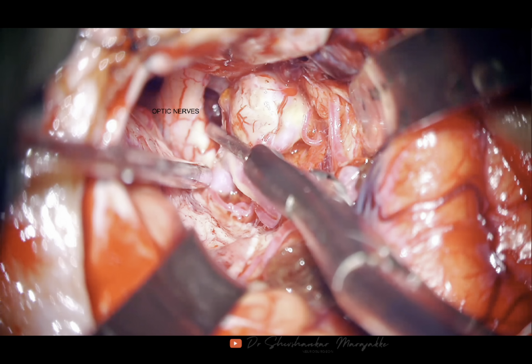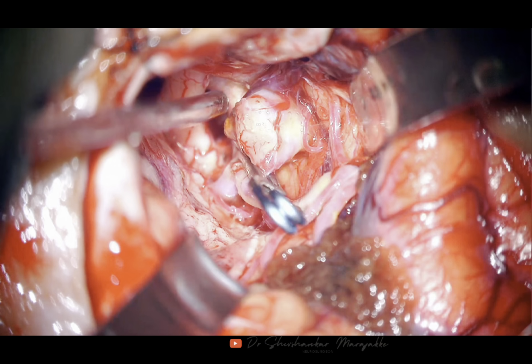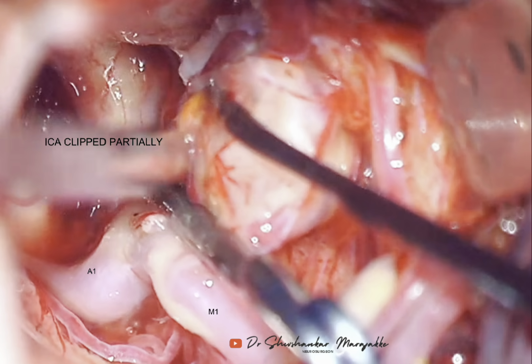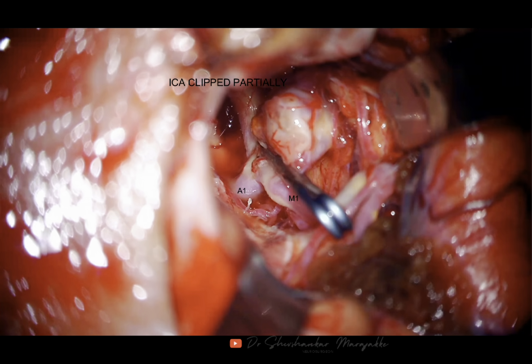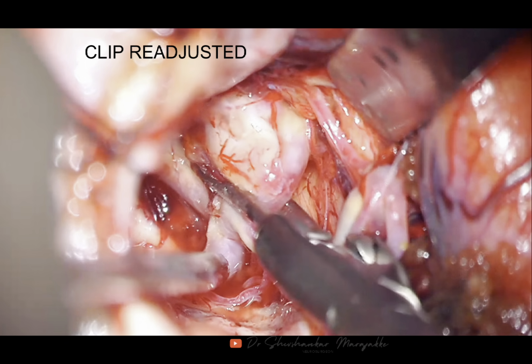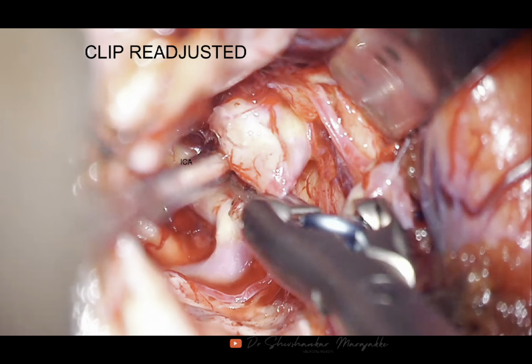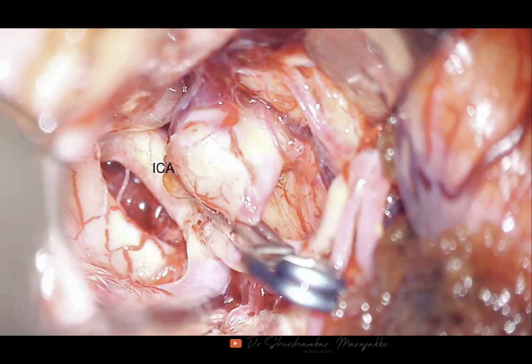So you can see that antetemporal artery I have not exposed. So I'll just clip it, and I have not put any temporary clip here. So you can see the ICA is partially clipped in the blades, because when I aligned along the neck, the tip was pointed towards it. So I have to readjust the clip so that the ICA, which is being included, is released from the clip. And then once it is done, I will turn the aneurysm on this side and dissect further to know the position of the antetemporal artery.